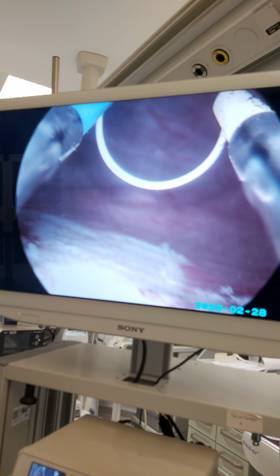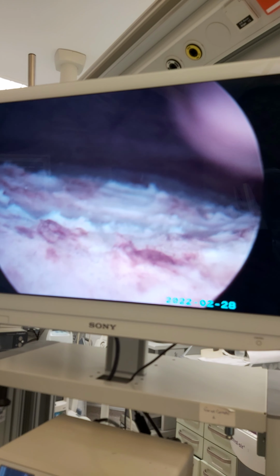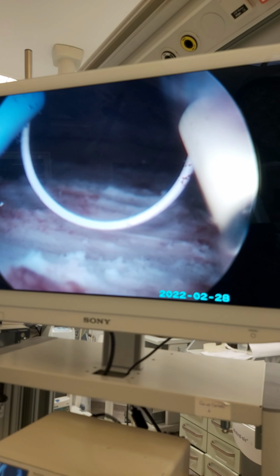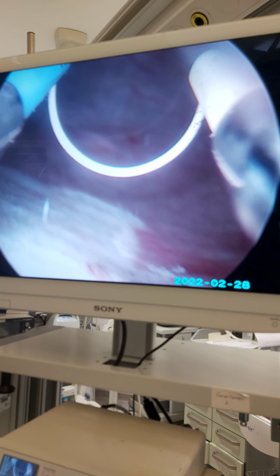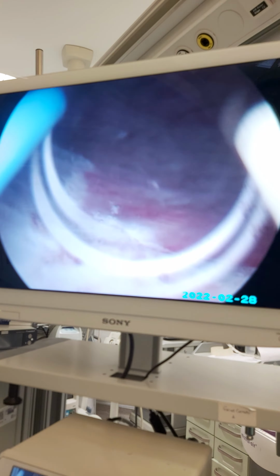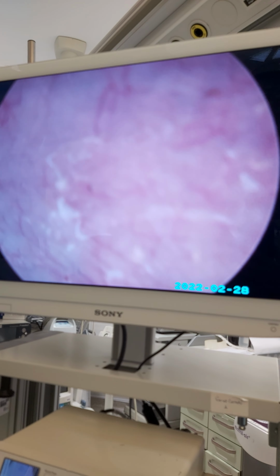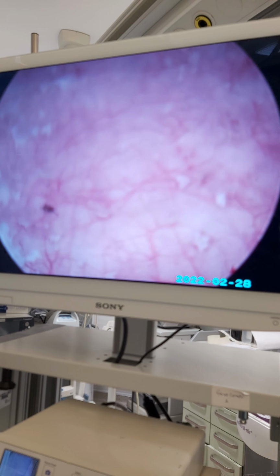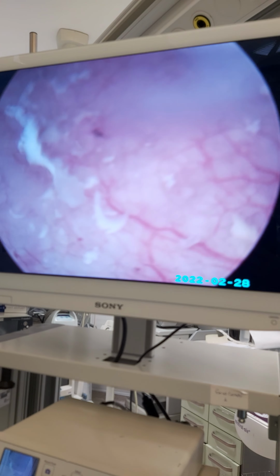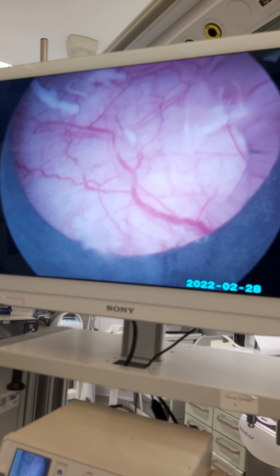We completed the procedure. These are the ureteric orifices. The previous fulguration was here, and now we corrected this place, fulgurated the residual leukoplakia, and the rest of the bladder seems healthy. These are the particles that come out, and now we will wash them out like a vacuum cleaner. We take them out like this.